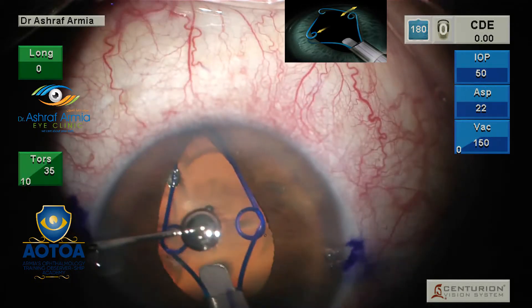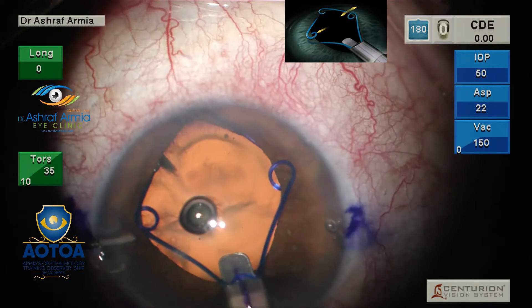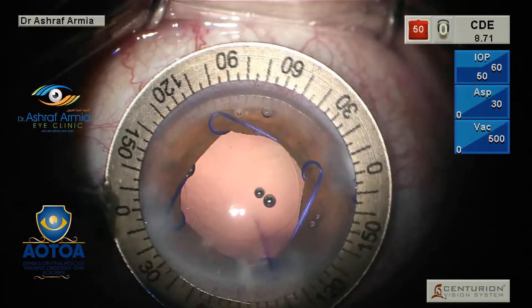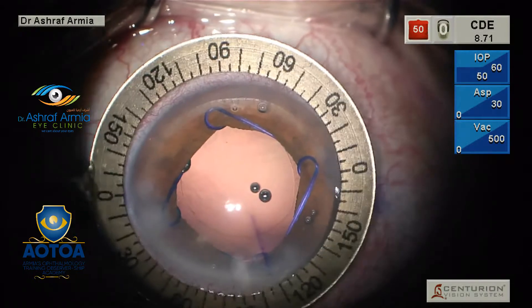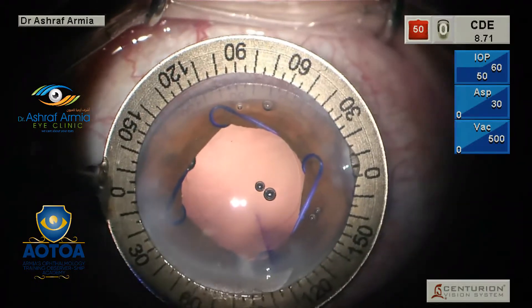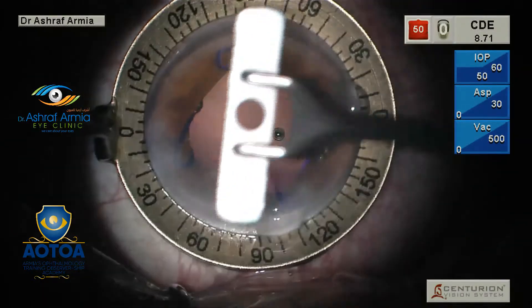This is how I'm using the Malyugin ring. After you place the Malyugin ring, you complete your phaco as normal, and after you finish, you mark the axis where you are going to align your IOL — which is the Technist Toric IOL in this case.